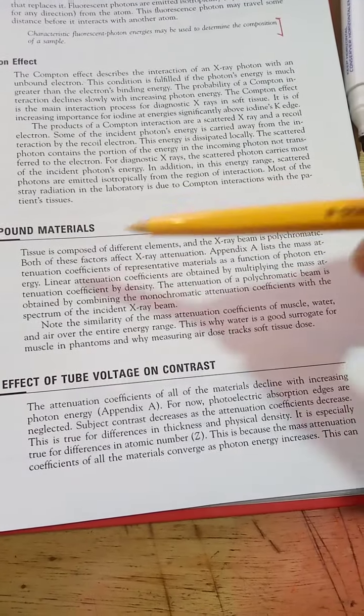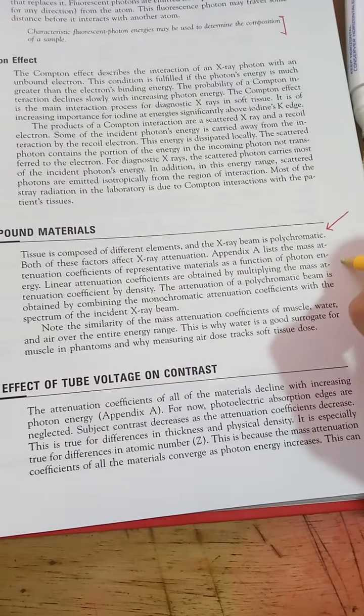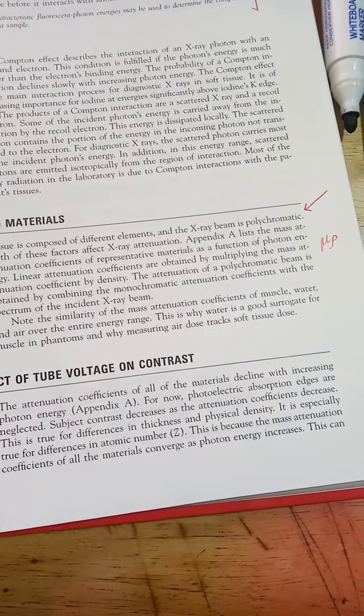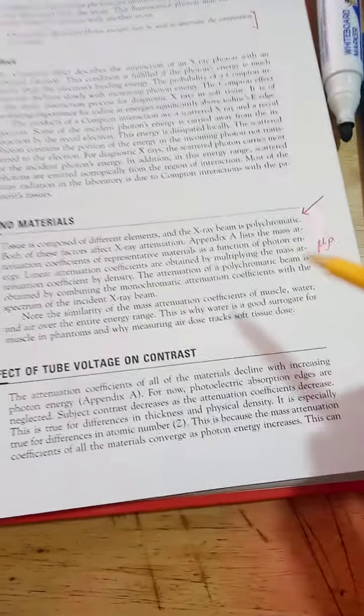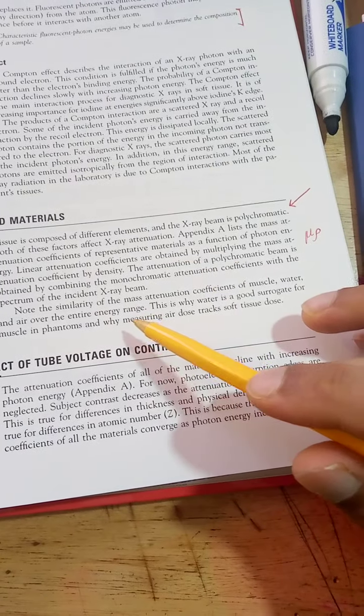Linear attenuation coefficients are obtained by multiplying the mass attenuation coefficient mu by the density, so mu times rho. The attenuation of the polychromatic beam is obtained by combining the monochromatic attenuation coefficients with the spectrum of the incident X-ray beam.